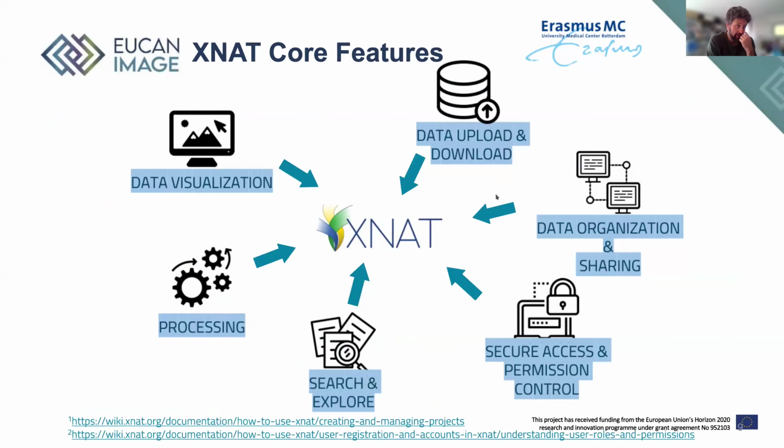So what's XNAT? What can it do for you? You can store your data. You can download your data here. You can organize and share this data with others. There's fine-grained, secure access and permission control. You can search through your data, and you can provide access to this data for processing.